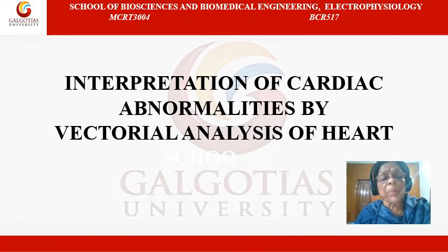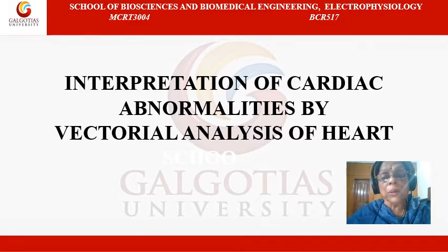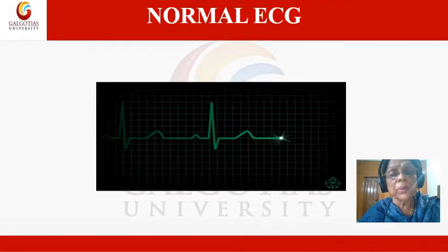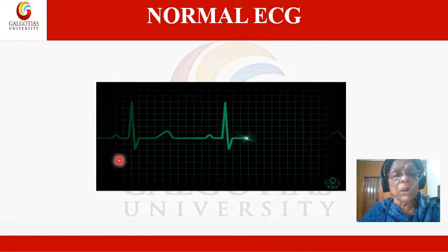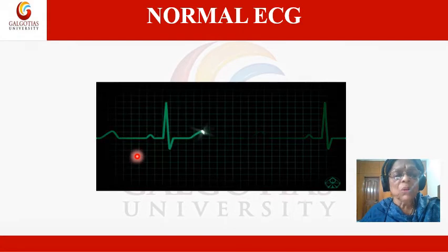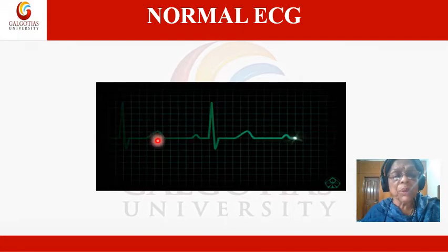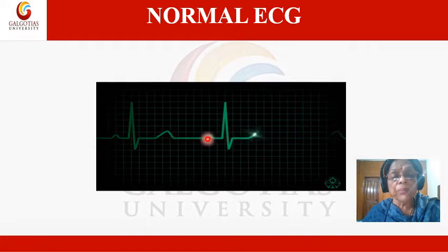Now, today's topic is interpretation of cardiac abnormalities by a vectorial analysis of the heart. This is the recording of the normal ECG, and as we know, the normal ECG has the P wave, QRS complex, and the T wave.